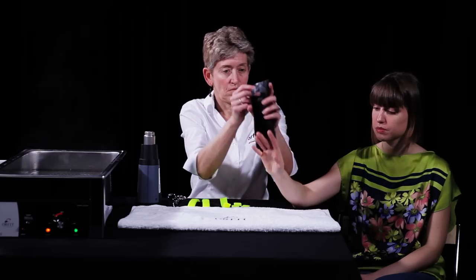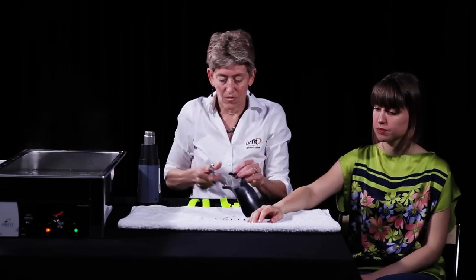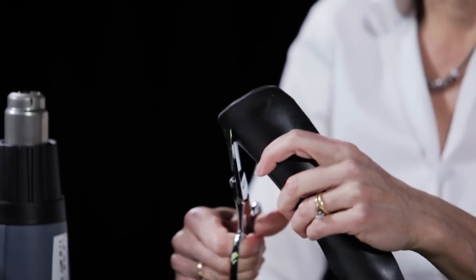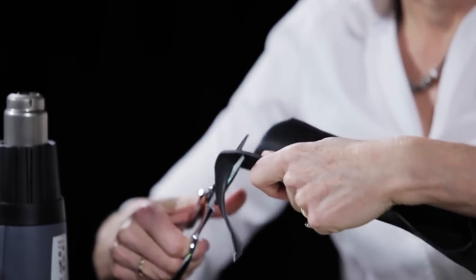Remove the orthosis from the patient for trimming. Round all corners and apply straps to the orthosis distally, proximally, and in the center.